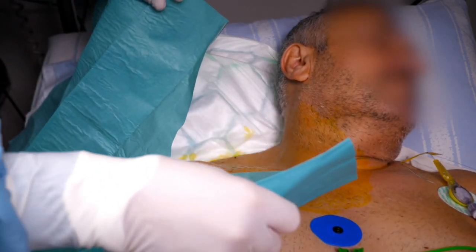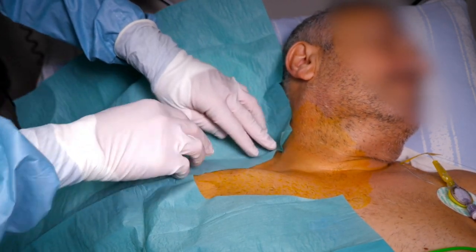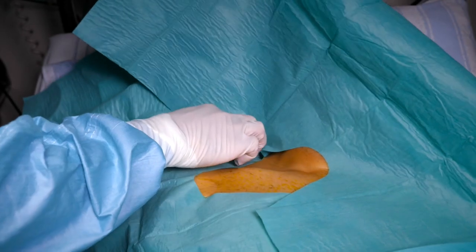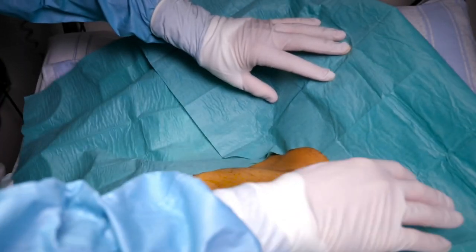While the patient is drying, you prep your tray. When you drape the patient, allow for a large enough area to access the puncture site, the supraclavicular fossa, and a backup location. I find that the adhesive two-parted drapes are extremely useful to achieve this.